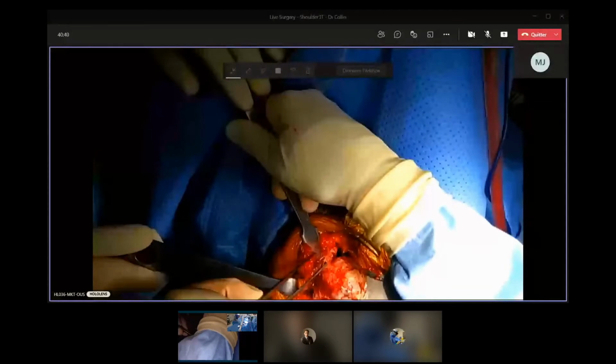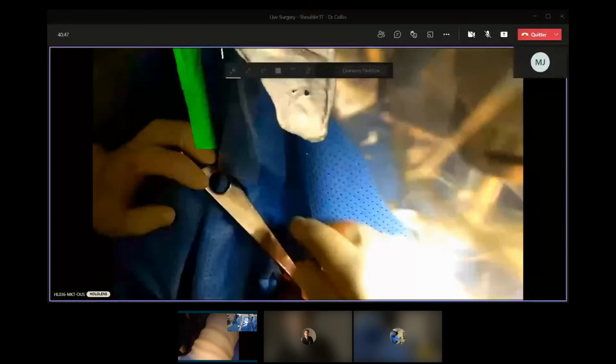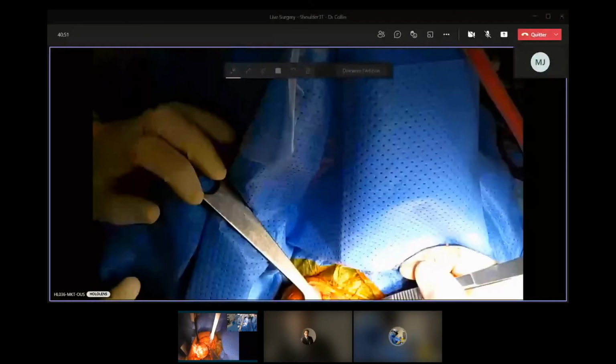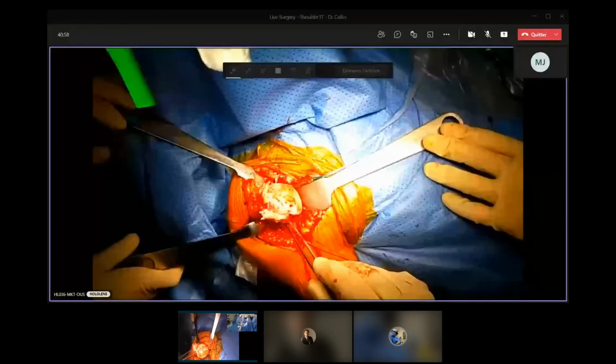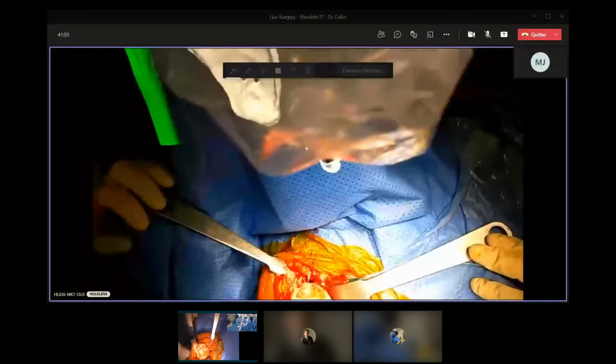So you can see that the indication for Philippe was perfect. There is no other option for this patient than a reverse shoulder arthroplasty. You can see perfectly the posterior cuff, which is a bad one. You can see here the subscapularis, which is very thin, but not detached. And you can see here the arthritis of the head.